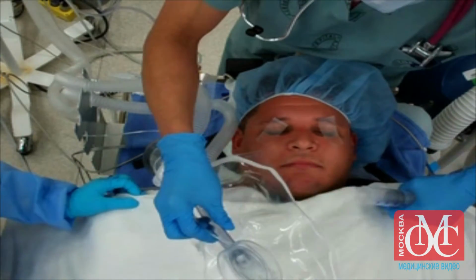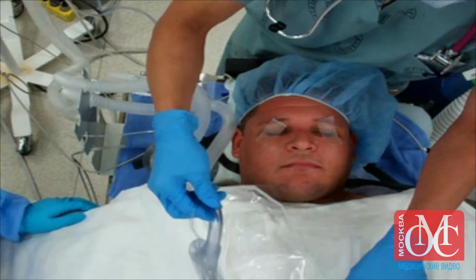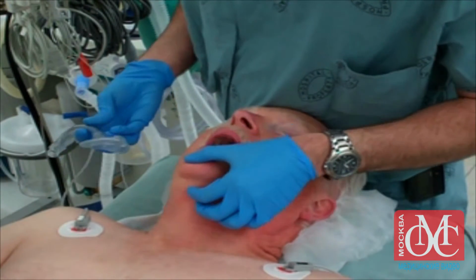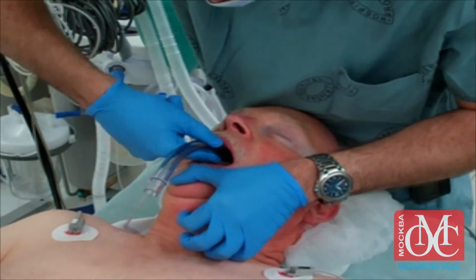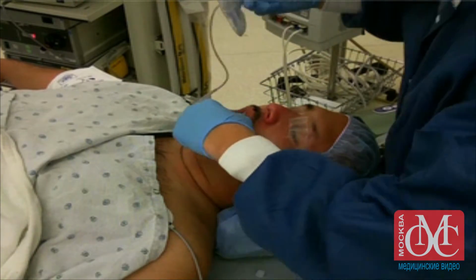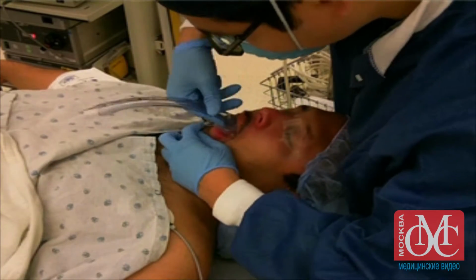The following sequences will demonstrate the placement of laryngeal mask airway in consenting adults undergoing elective surgical operations. With the patient in the supine position, gently tilt the head backwards to facilitate placement. Do not perform this backwards tilt in an unconscious patient in whom a neck injury is suspected. Place a straight laryngeal mask airway, open the mouth as fully as possible, and insert the device into the mouth, directing the posterior cuff against the hard palate.